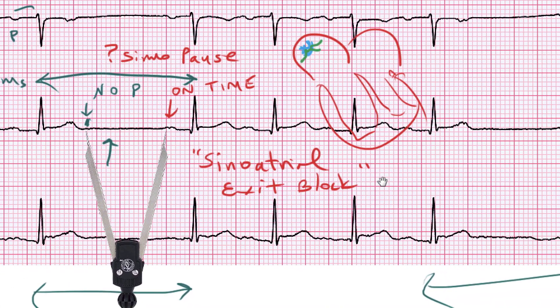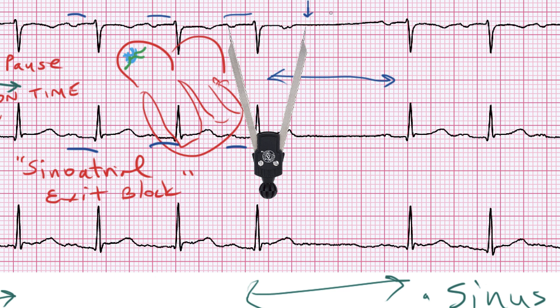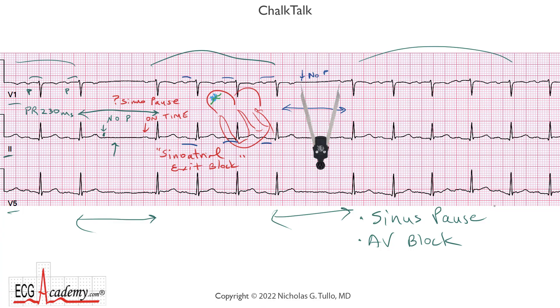Let's keep looking at this strip. There's another pause here, and if we take the P-to-P interval and move it over, we can see that where we would have expected a P wave, there is no P. But if we make a mark and move our calipers over, we can see the next P wave is pretty much on time. So at first glance it would appear to be a sinus pause, but it seems consistent with SA exit block. Following that, the sinus rhythm resumes and you have one-to-one conduction with just a first degree AV block.